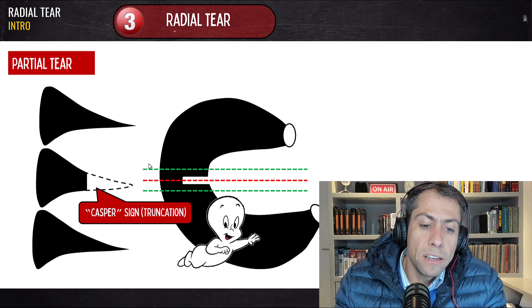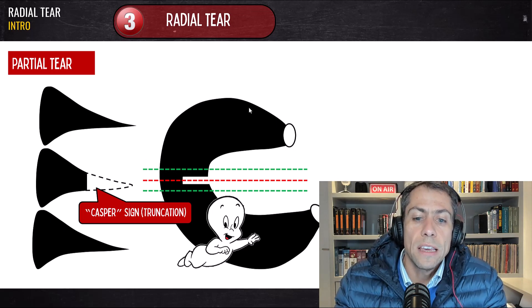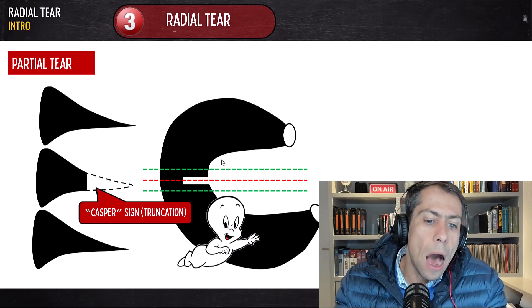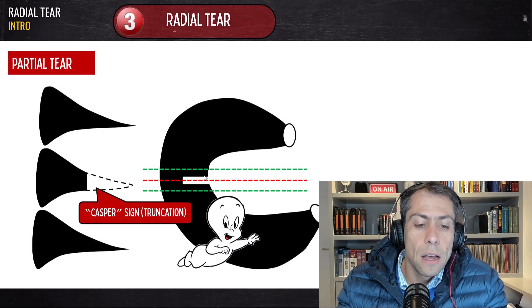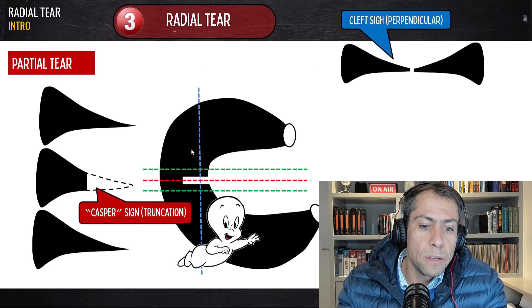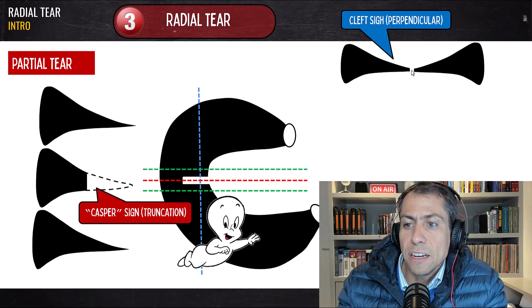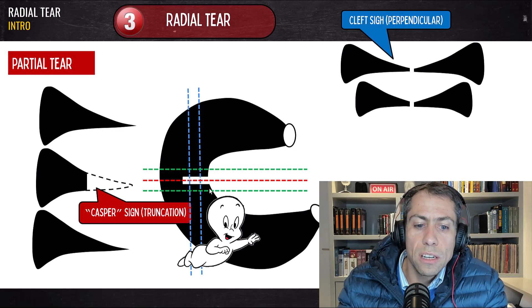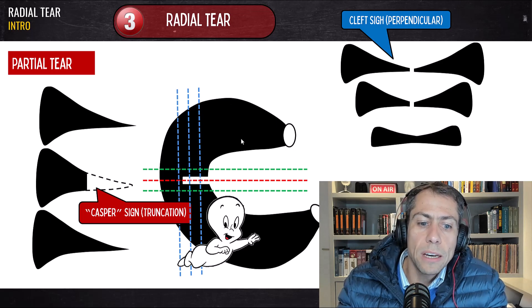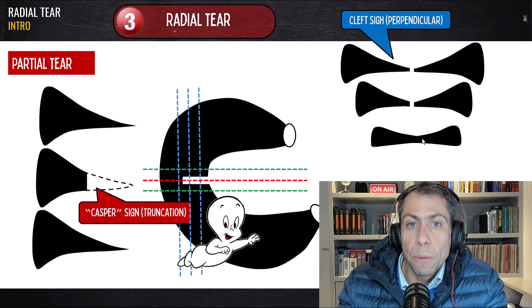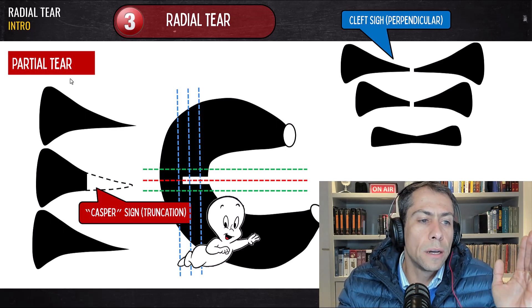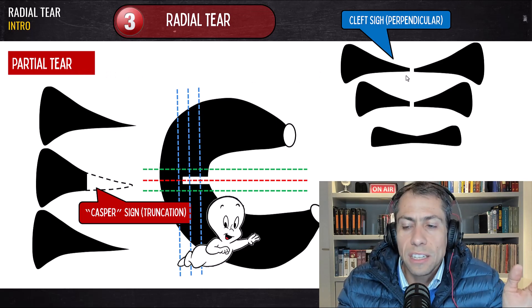That's how we see the partial meniscal tear on the same plane of the tear — for the meniscal body that is the coronal plane; for the anterior horn and posterior horn, it's the sagittal plane. Now let's see how we'll see this on the plane that is perpendicular to the radial tear — in this case the sagittal plane. We will see the cleft sign: a cleft at the inner margin of the meniscus. It's just a partial cleft sign because at the periphery the meniscus is normal.